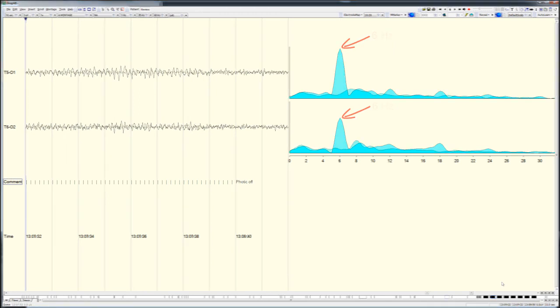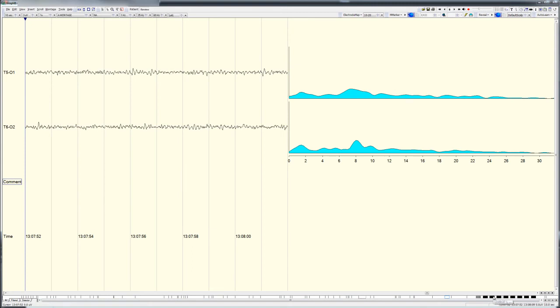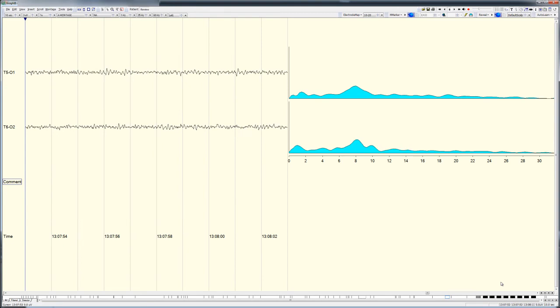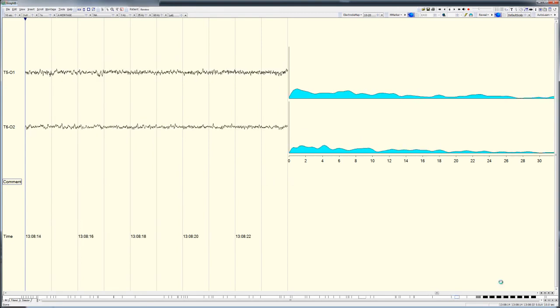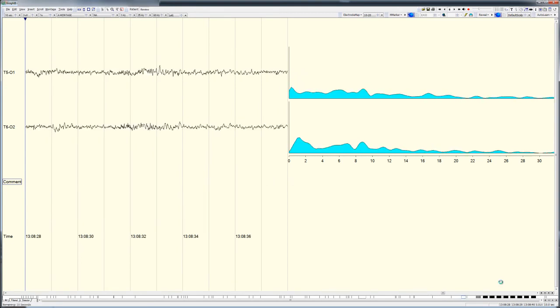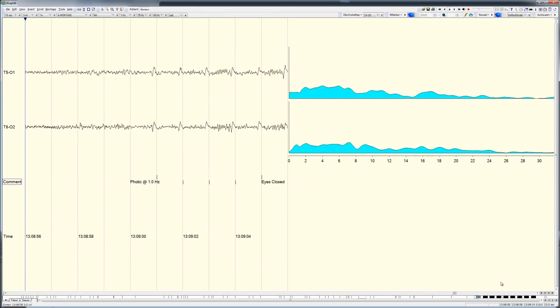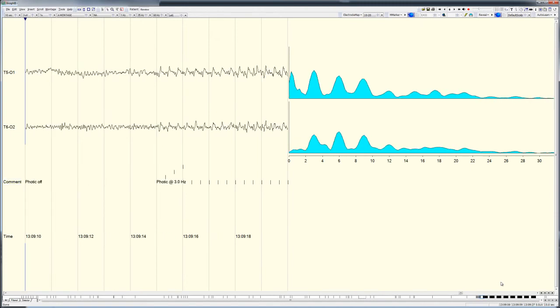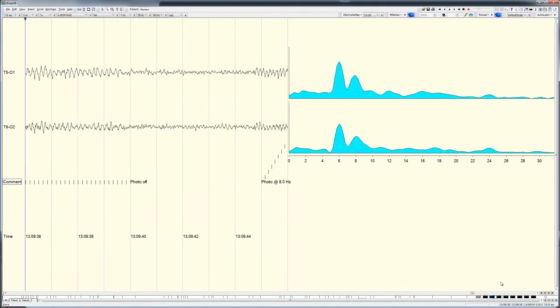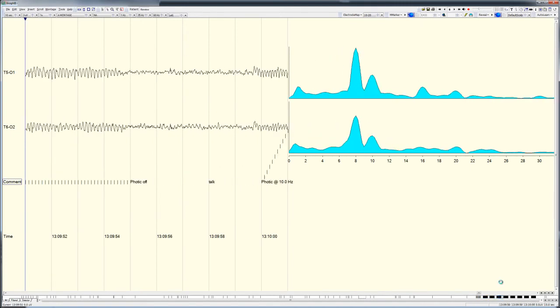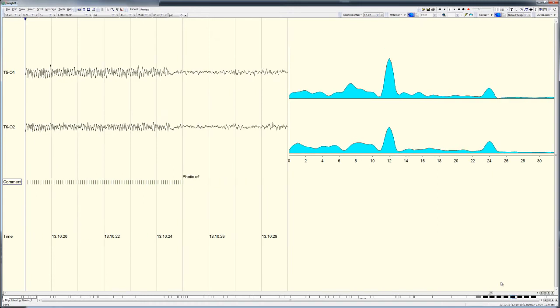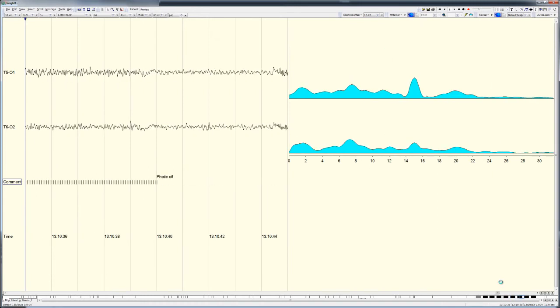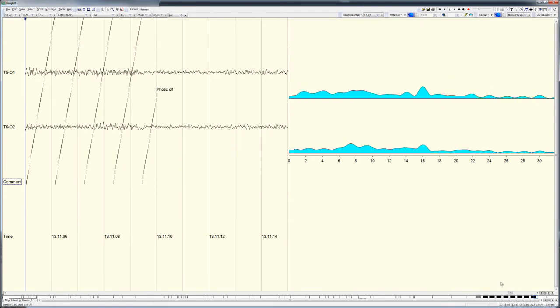Now let's look at the EEG and its accompanying FFT line spectrum throughout the entire photic stimulation run. I'll scroll through the EEG second by second, and on the right you'll see the simultaneous FFT line spectrum derived from 4-second EEG epochs. Notice how peaks of spectral power appear and disappear at the various photic flash frequencies as the photic stimulator is turned on and off.